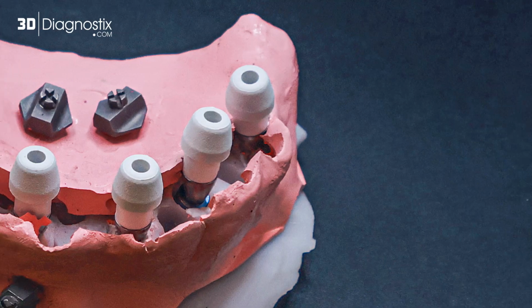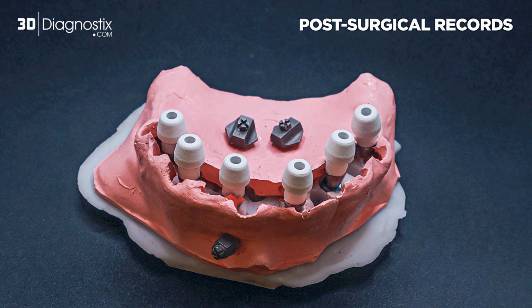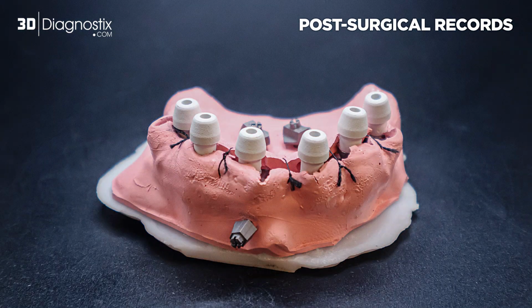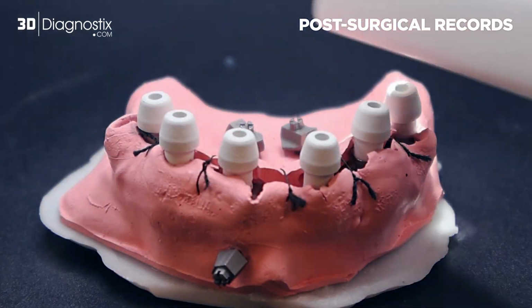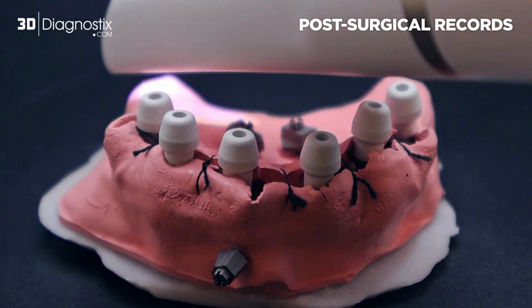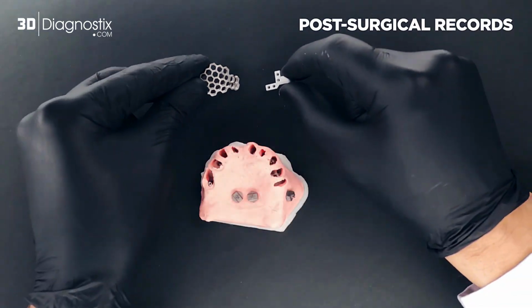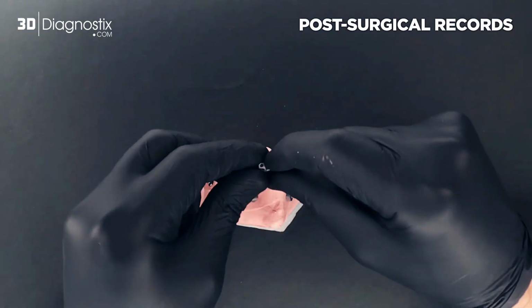After implant placement and multi-unit abutments are secured, place the OPTISPLINT MUA scan caps on the MUAs and then suture the tissue. Then proceed with scanning of the soft tissue and arch tracers while making sure that the arch tracers are stable in their position from the preoperative scan onward. Then replace the scan caps with the OPTISPLINT scan bodies, aligning the wings inward.